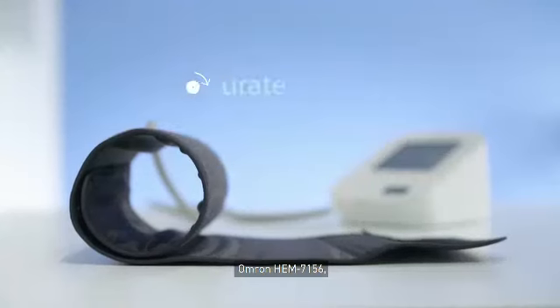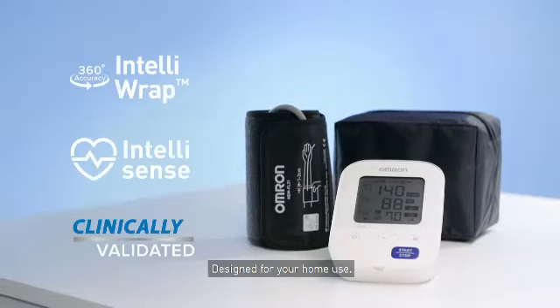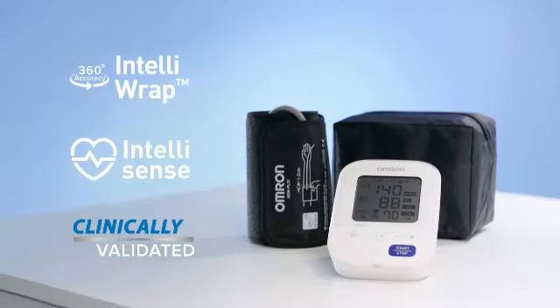Omron HEM 7156. Accurate. Comfortable. Intuitive. Designed for your home use.